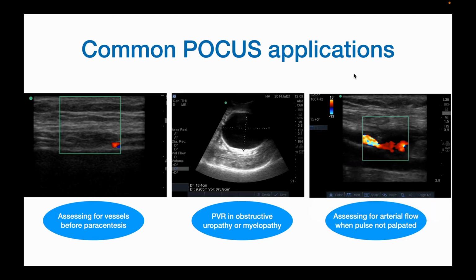And this is where using color Doppler alone is able to actually detect presence of blood flow. My advice is that you take the time to explore the different calculations and modes available. Really, the more you learn and practice, the more you'll realize the amazing capabilities with POCUS.